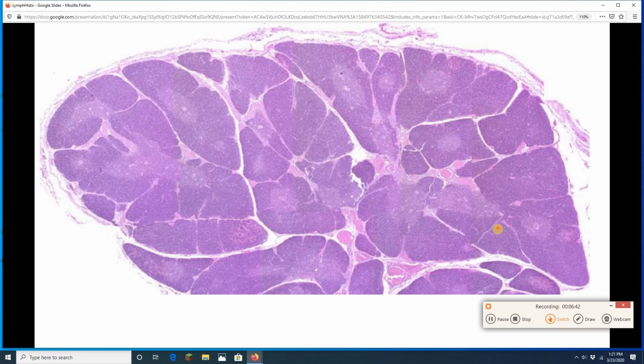This is the thymus. This is an infant thymus. The infant thymus is awesome because it is the training ground for T lymphocytes. It is where we make sure T lymphocytes are going to attack foreign things but not attack our own tissues. This is where T lymphocyte maturation or education occurs. Check out the purpleness. Purple again, lots of lymphocytes, T's in this case.